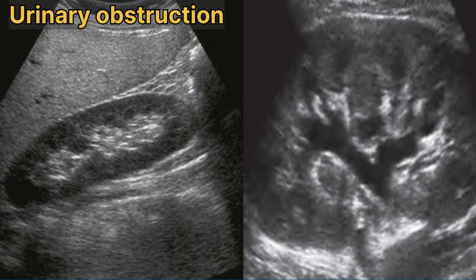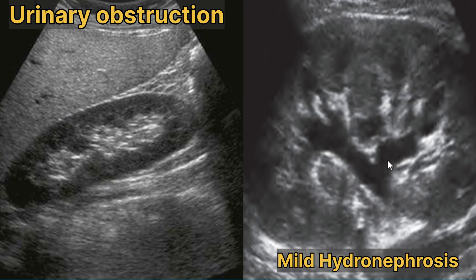Now we are going to discuss urinary obstruction. About 5% of patients with renal failure suffer from urinary obstruction. Mild or grade 1 hydronephrosis refers to a minimal amount of urine producing slight distension in the collecting system. In this sonogram we can see normal renal parenchyma adjacent to the liver, where grade 1 hydronephrosis causes only slight distension of the collecting system.